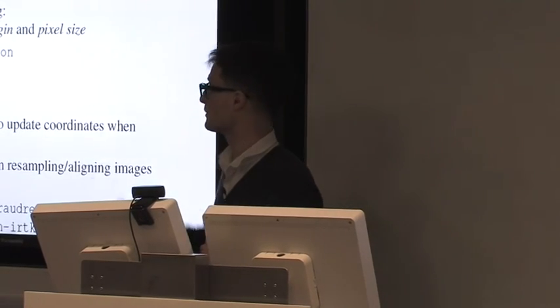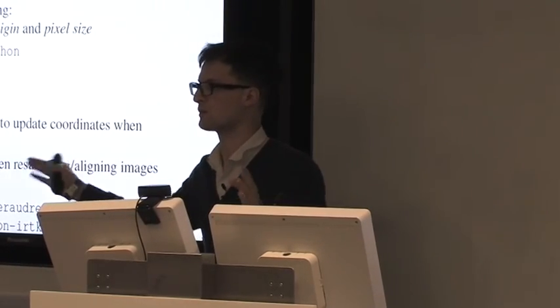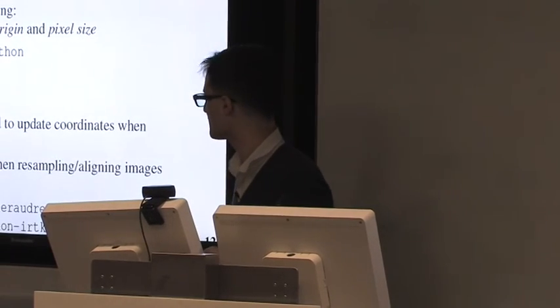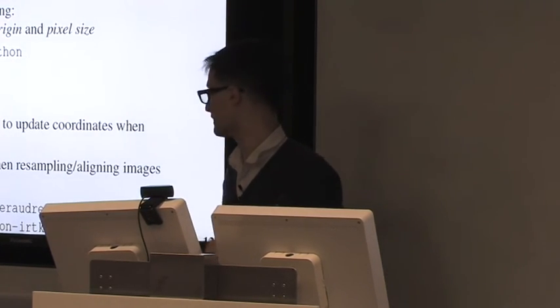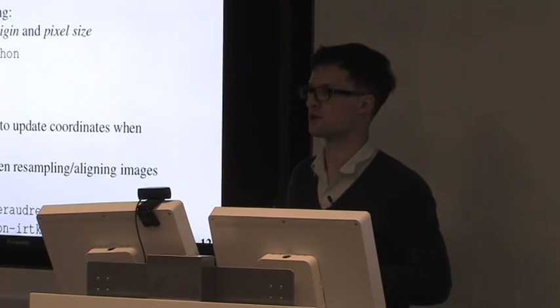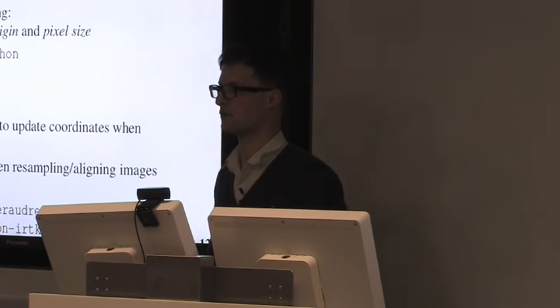And as you see with my problem of finding organs in different blocks, 3D volumes, and then merging the volumes together, I'm very interested in preserving those 3D coordinates. And you also want to preserve those coordinates when you do some resampling. Otherwise you could just use a SciPy ndimage resample, but that won't preserve your coordinate system.